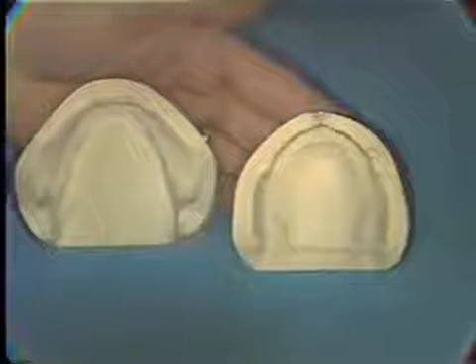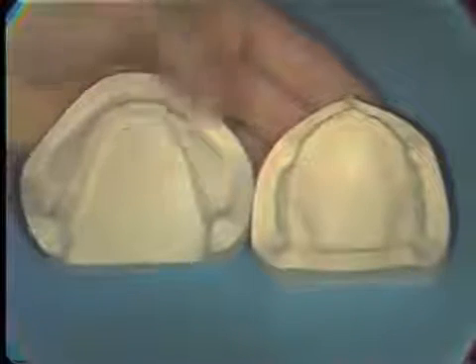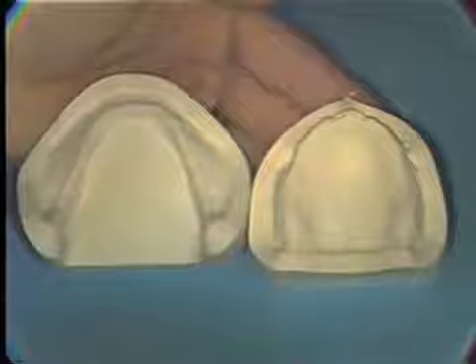And after thoroughly wetting the surface of these casts, they can then be taken to the model trimmer and trimmed in such a manner that the final preliminary model will look similar to these, with a landing or boxing edge of approximately 1/4 inch around the entire periphery.